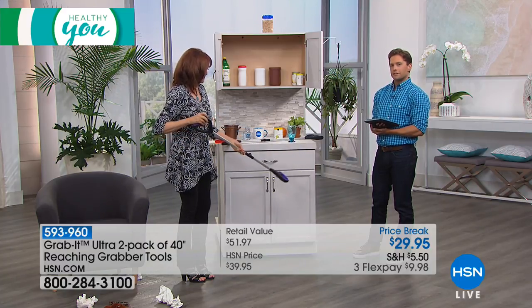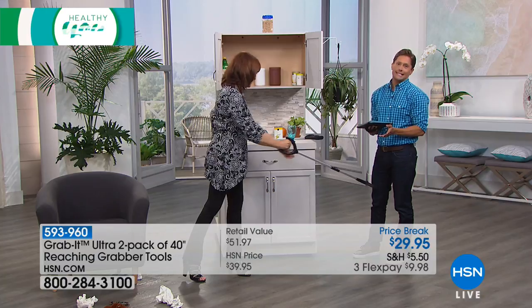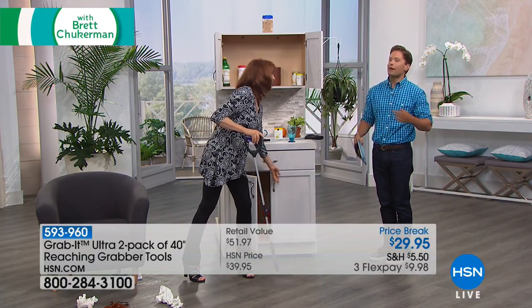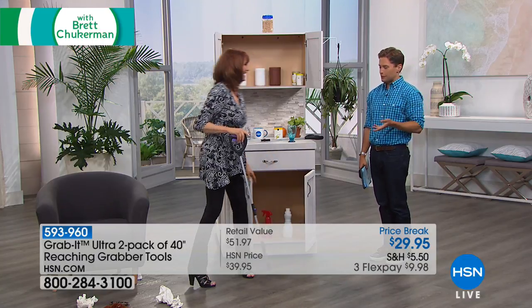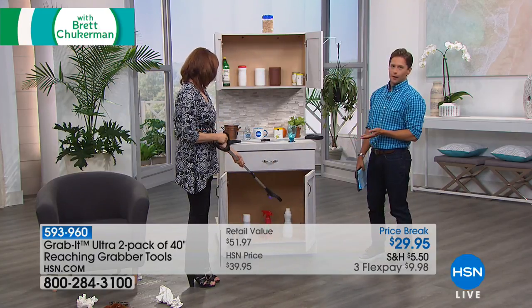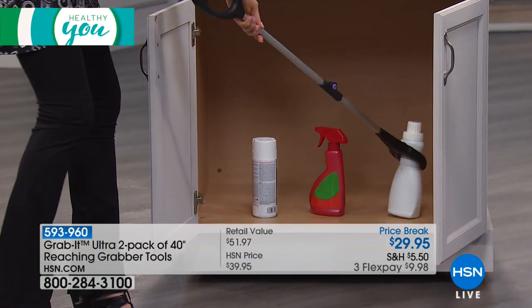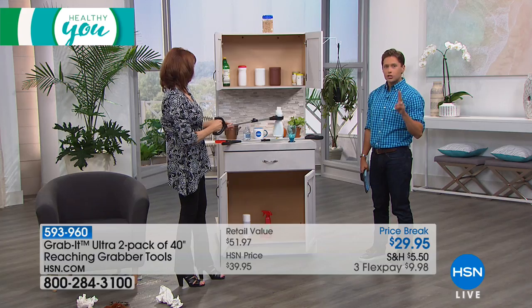You don't have to worry because the Grab It holds those things for you, maybe because you have dexterity issues, your wrist hurts, your arm hurts and you can't hold it. You can grab it but you wish somebody else would hold it — the Grab It can do that. And when you're feeling frisky you can get somebody's attention with it. Happy is healthy — when we live a fun life we're happier, we're healthier. It's a wonderful helpful tool to own, and remember you're getting two.